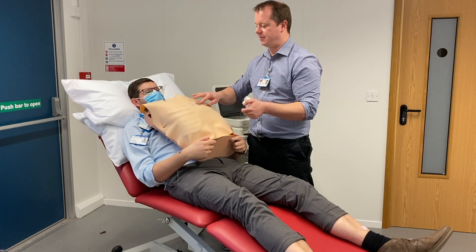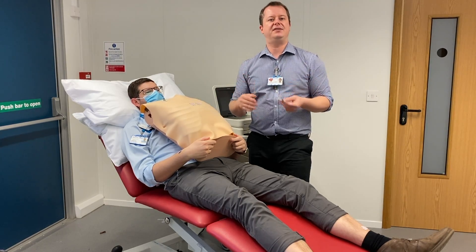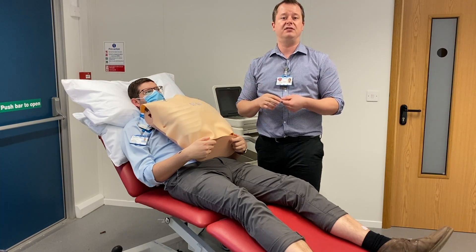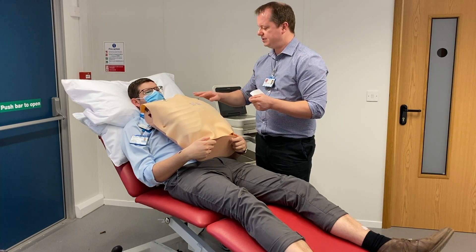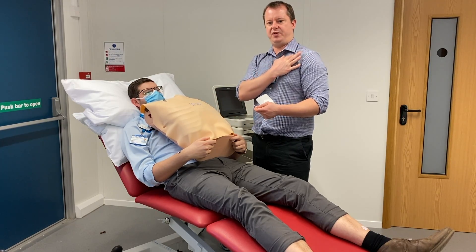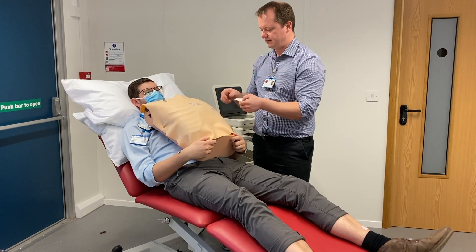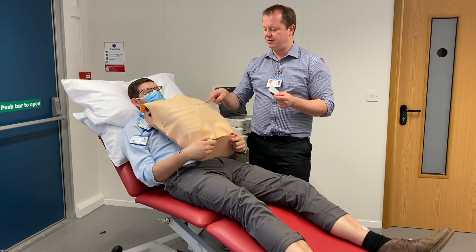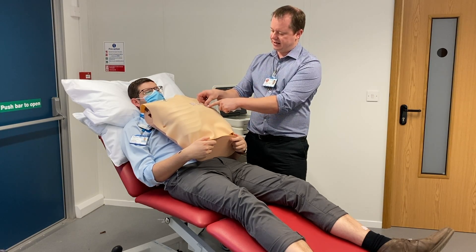V2 goes on the fourth intercostal space, half on the sternum and half off the sternum, on the left hand side. The next one we want to put on is V3, but V3 doesn't have any landmarks on the human body we can line up to, so we actually skip V3 and go to V4. V4 goes in the fifth intercostal space at the mid-clavicle line, so we find our clavicle, find the midpoint, go straight down, and place it in the fifth intercostal space.